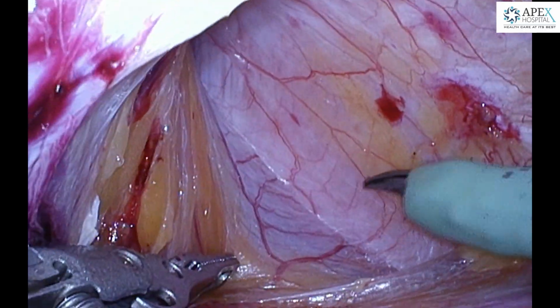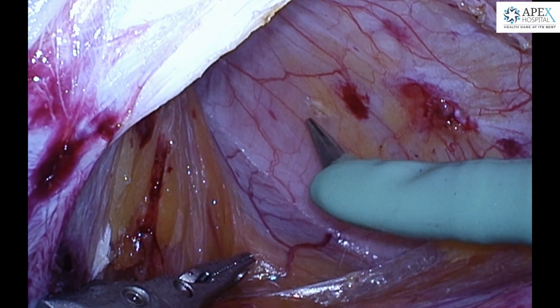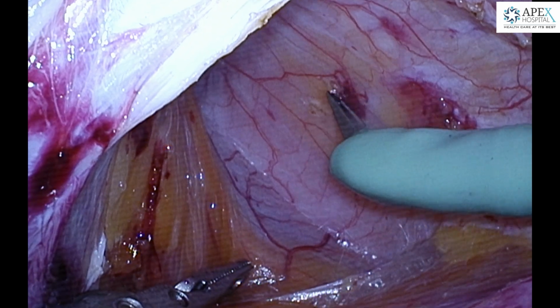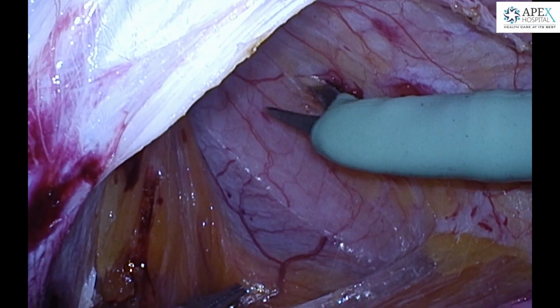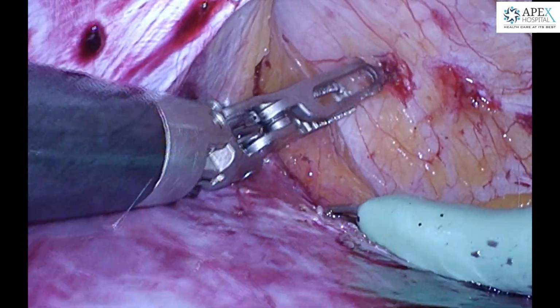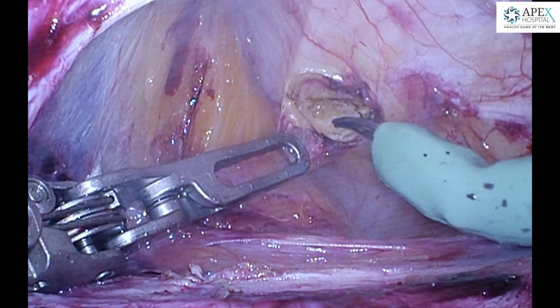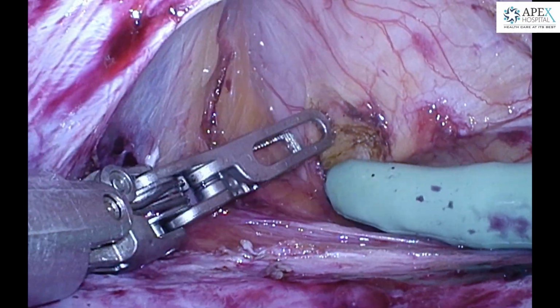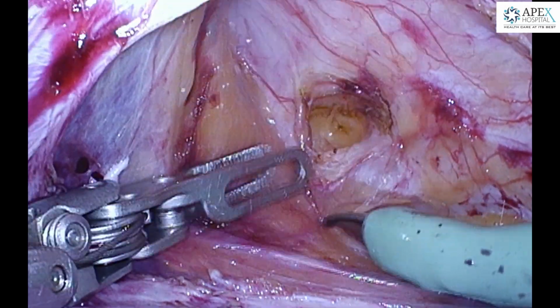However, because this patient has significant divarication in the upper part in the M2 and M3 region, it is being difficult to identify the posterior rectus sheath, and inadvertently the linea alba has been damaged here, which we realize once we open and find that we have reached the subcutaneous fat.